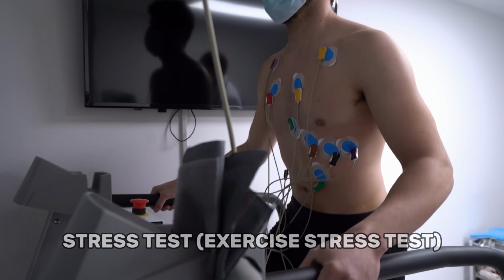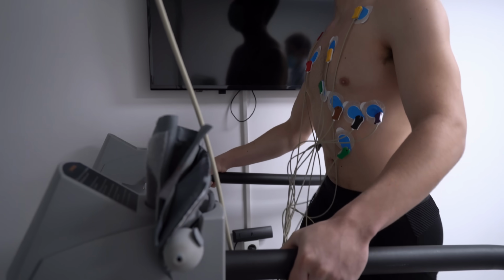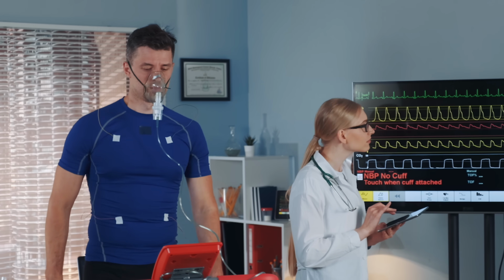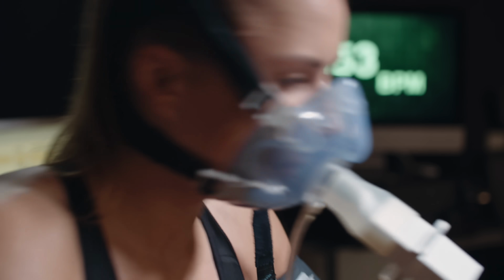Okay, so that's number one. So what's number two, Mike? So, stress tests. A lot of people have had stress tests. These are plain old exercise stress tests. People will be familiar with them. I think it's a low risk procedure. We pop you on a treadmill. We ask you to exercise as best as possible. Stress tests are standardized. We know we're not making it up as we go along. There's a standard place where we put the leads, and there's a standard kind of ramping up in terms of the speed and the grade of the treadmill.